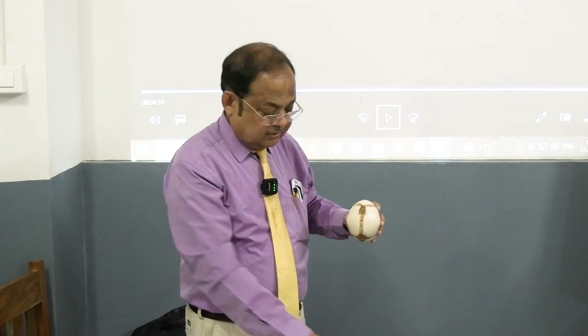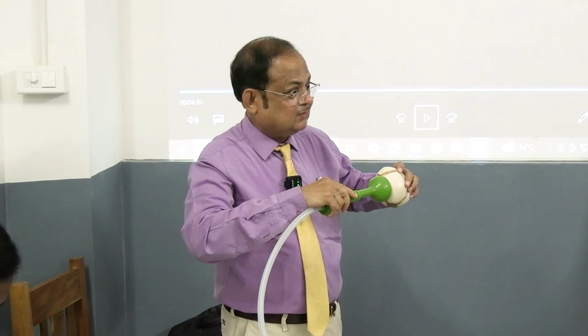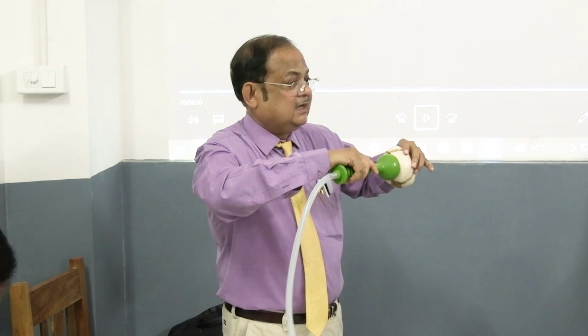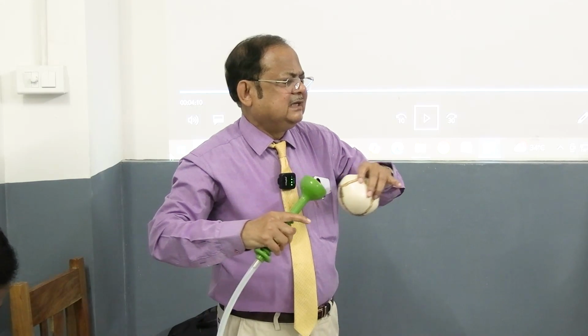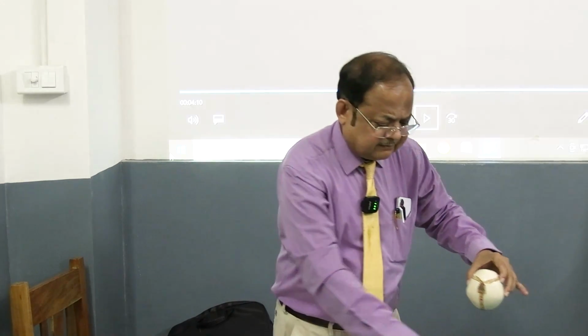And so you will apply it at the flexion point, 3 centimeters and 6 centimeters. A flexion point is a point on the sagittal suture. The advantage of the flexion point is that when you give the traction, the minimum diameter will come. And there is also correction of asynclitism. Asynclitism means the head may be delivered with the sagittal suture deviated.